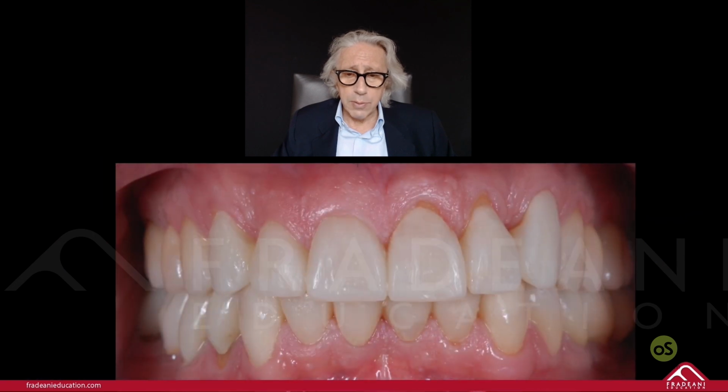So now, provisional in place, well integrated also aesthetically. Big difference between before and after. And now the patient, starting from that, changes his mood completely, different, showing teeth in a perfect way.